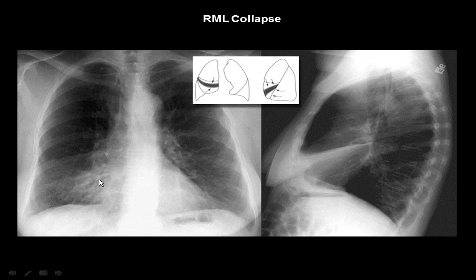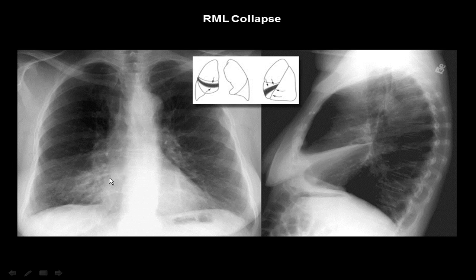The middle lobe is adjacent to the right cardiac border. When it loses its volume, what we call right middle lobe collapse occurs — like we can see in this illustration: the white image of this right middle lobe adjacent to the heart. On the lateral view we can differentiate it from the right cardiac border. So it's a right middle lobe collapse.